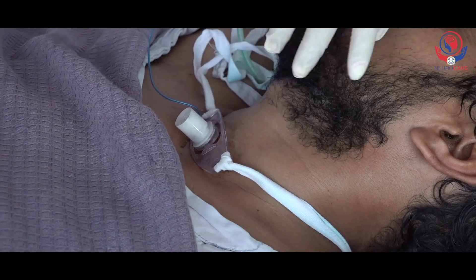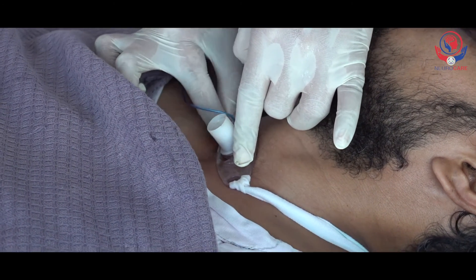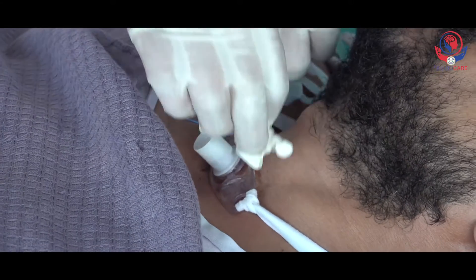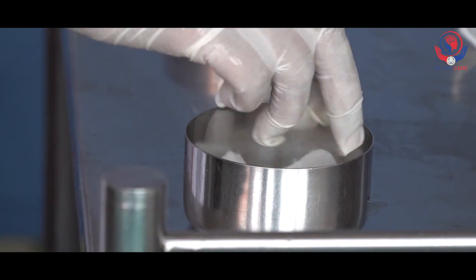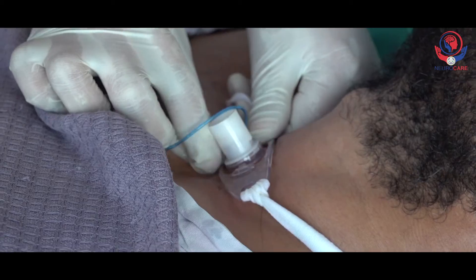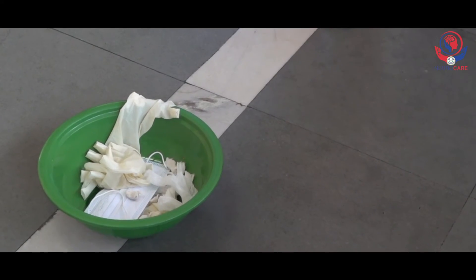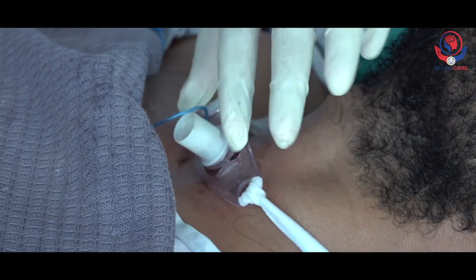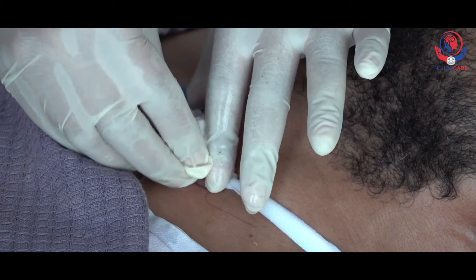Don another pair of paper or clean gloves and wash your gloved hands with hand rub. Gently clean the area around the tracheostomy opening with cotton swabs soaked in boiled water. Squeeze the cotton swabs properly before cleaning. Use a single swab for a single wipe. Discard used swabs into the dustbin.